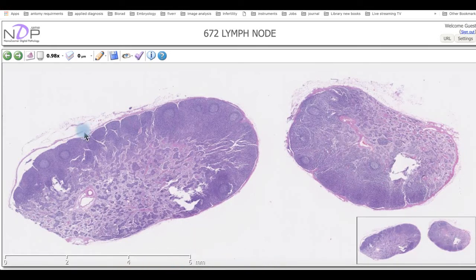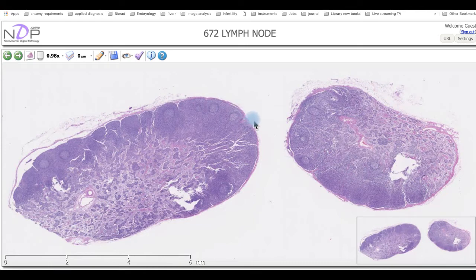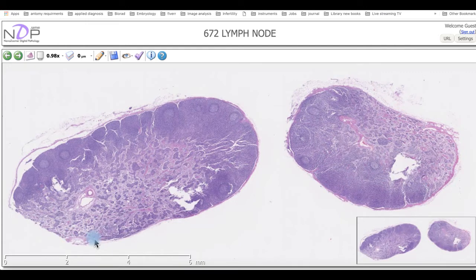Looking at this slide of the lymph node, we can see that from outside it is supported by a capsule. This capsule is a dense irregular connective tissue. The capsule sends trabeculae, and these trabeculae are collected in one area called the hilus.